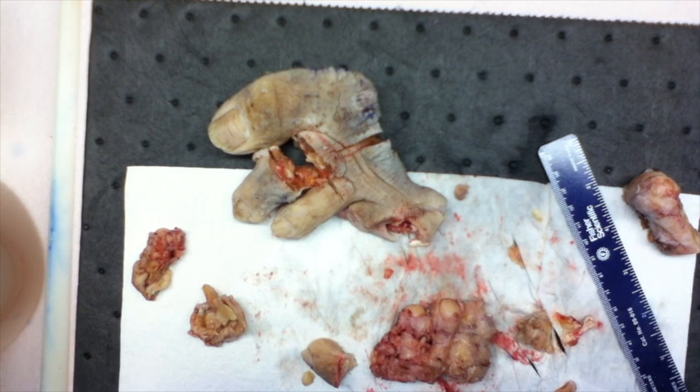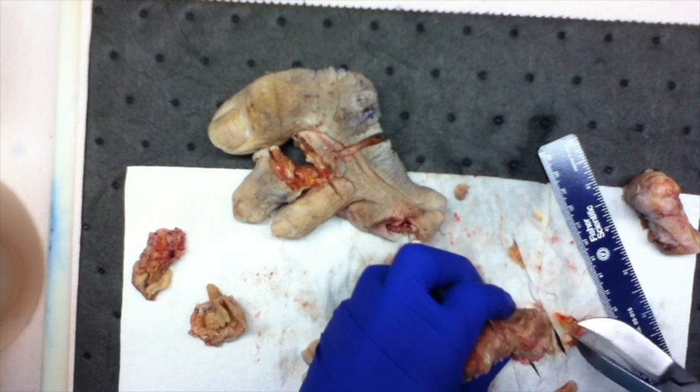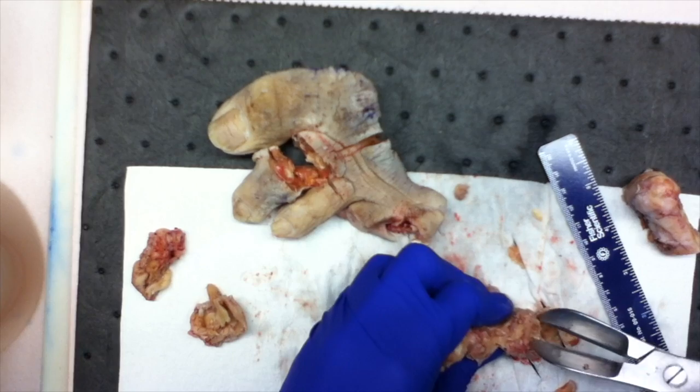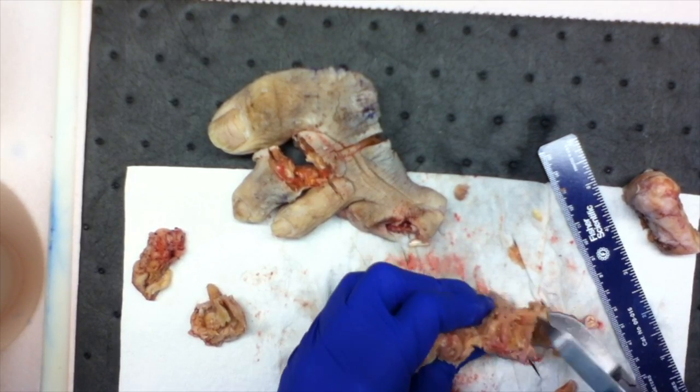And so we took from the second, fourth, third toes. So what we'll need to do is take margins from all that. I typically like to go in order. Just makes it so much simpler. So this is going to be my second metatarsal bone margin.